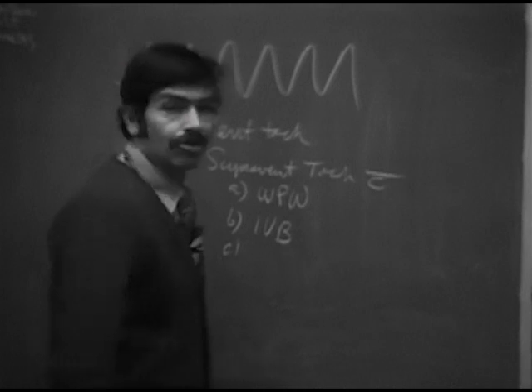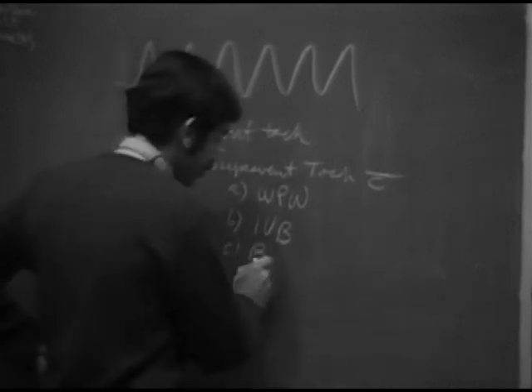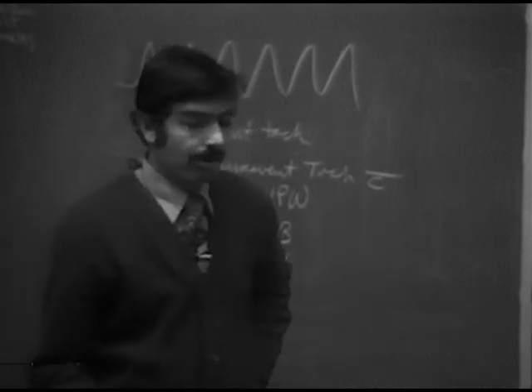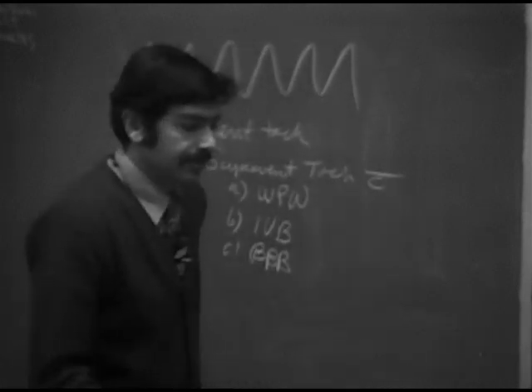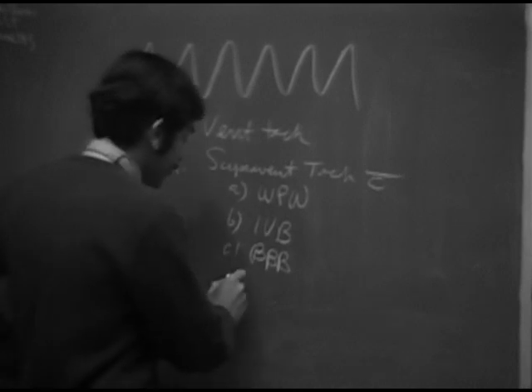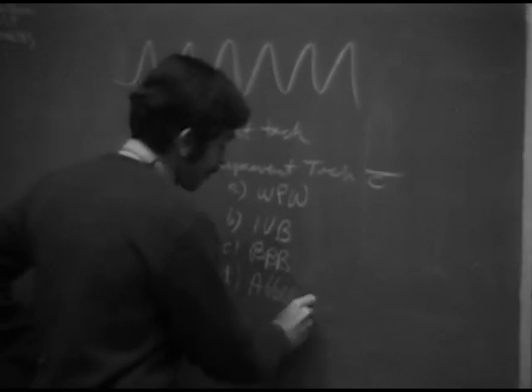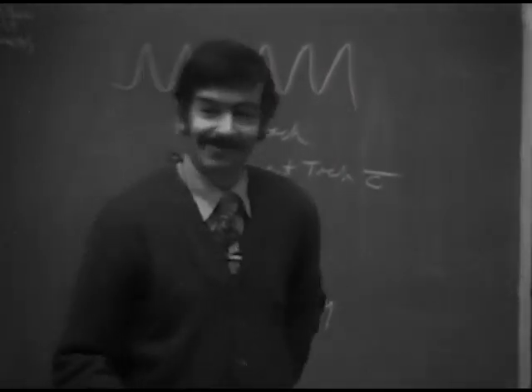If the terminal portion of the QRS is prolonged, we think of bundle branch block. And also a form of rate-related bundle branch block, or as occasionally it's not necessarily related to the rate, aberrancy. I'm not sure I spelled that right, but it's something like that.